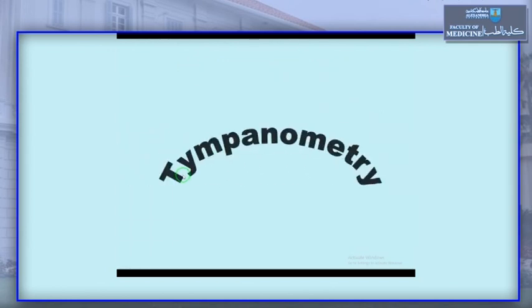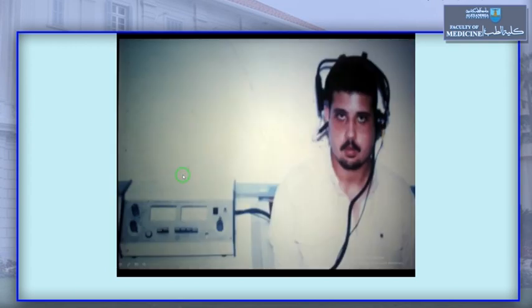Now I come to the third test, which is tympanometry. Tympanometry, as the word entails, metry means measurement, tympano is measurement of the middle ear. This test is specific for middle ear diseases, and the machine or the instrument we are using in order to test for tympanometry is called impedance meter or tympanometer. As you can see, the patient is seated beside the instrument, and I will not go much into details of the machine or how it works, because that's outside the scope of this lecture.